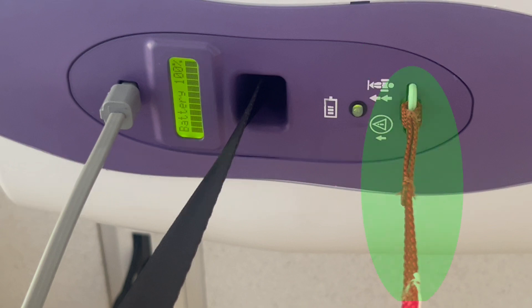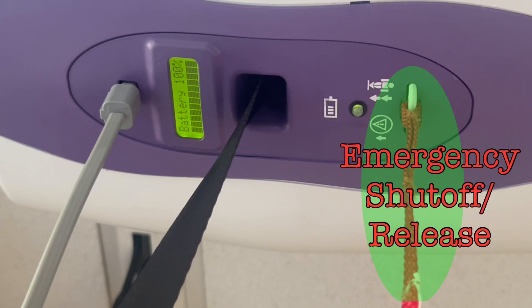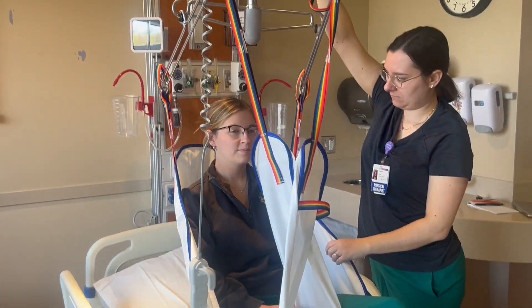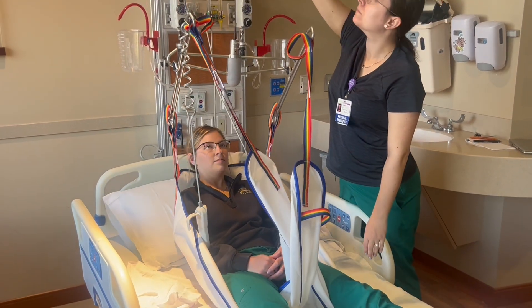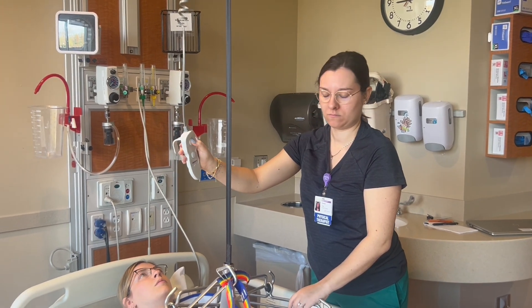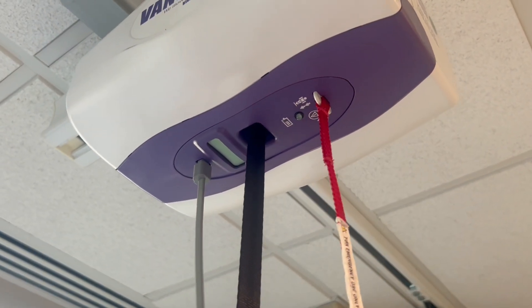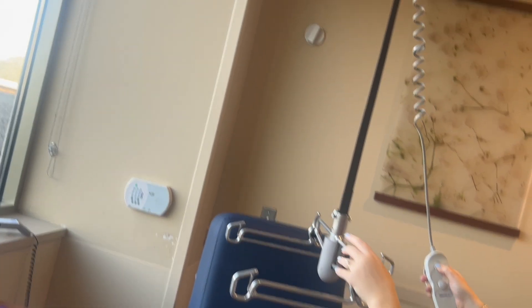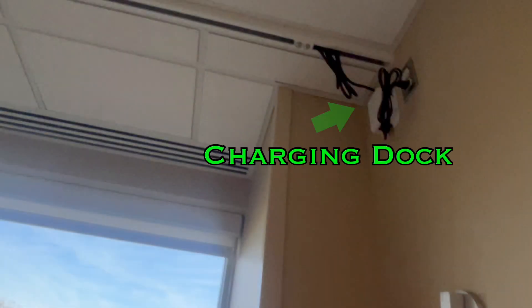Next to the indicator light is a long red strap — this is the emergency shutoff and release. If the lift stops working while transferring a patient, because maybe the battery died or the control unit got disconnected, you can still safely lower the patient with this emergency cord. Pulling the cord will release a small white clip, disconnecting power from the unit. If you continue to pull on the cord, it will slowly lower the patient. You will hear a continuous alarm tone while the patient descends, and it will stop when you let go. If you've used the emergency release, the lift will no longer function until you push that white tab back into the lift motor to re-engage the battery. When not in use, the lift should be docked on the charger at all times so that you never run into the issue of a fully depleted battery.